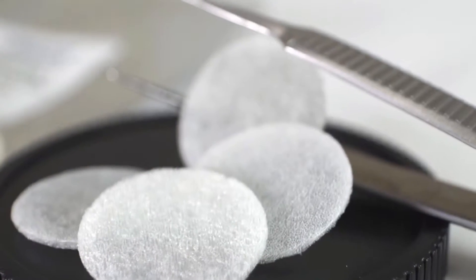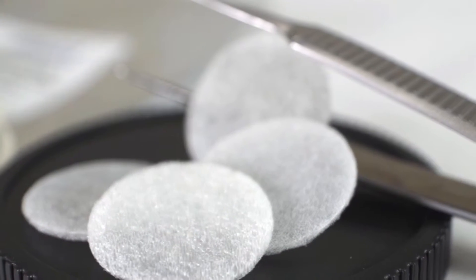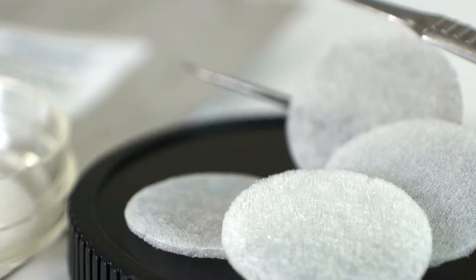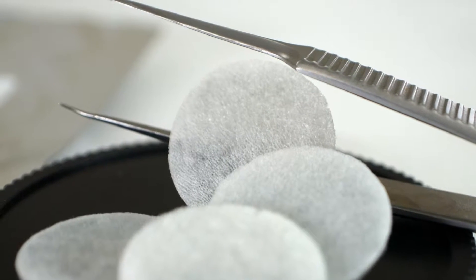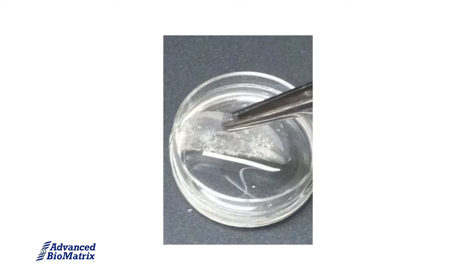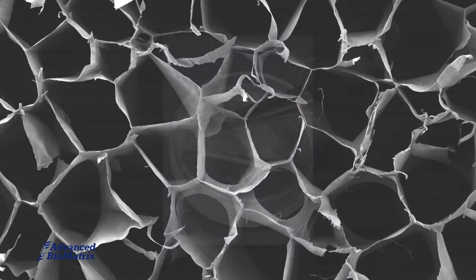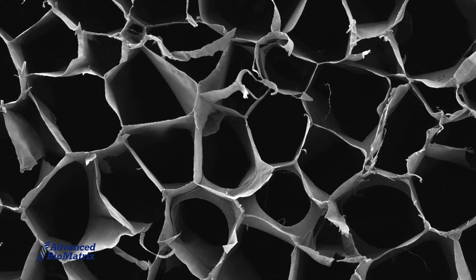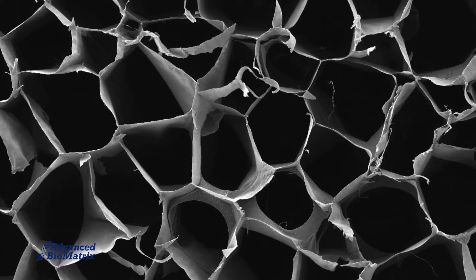SpongeCol is a type 1 collagen sponge with a unique columnar porous network that permits cells and nutrients to flow completely through the sponge and provides an increased surface area for cell attachment, growth and migration. SpongeCol is lightly cross-linked for increased mechanical strength and durability for both short and long-term tissue culture. The diameter of the pores average approximately 200 microns, which is optimal for the proliferation and growth of cells within the pores.